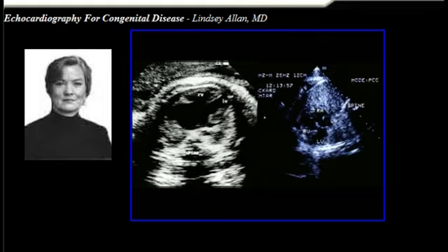The other clue to the diagnosis in this particular fetus is there's a little pericardial effusion, which is a common feature of Down syndrome. And this fetus was detected as part of the 4-chamber view screening program, and the mother was 18 weeks gestation, the heart was examined, the abnormality was detected, she was referred for further evaluation, the chromosomes were analysed, and she had the information of Down syndrome prior to 20 weeks gestation at a time when she could consider interrupting the pregnancy if that seemed like the correct management for her particular family.